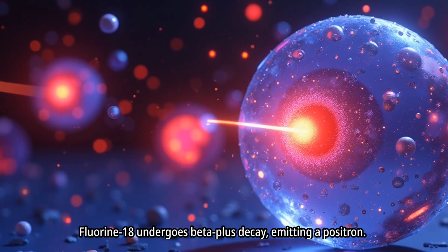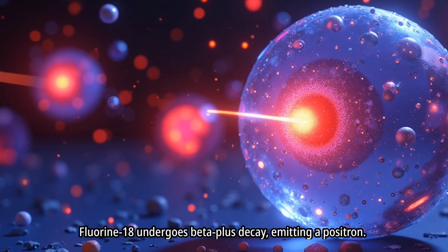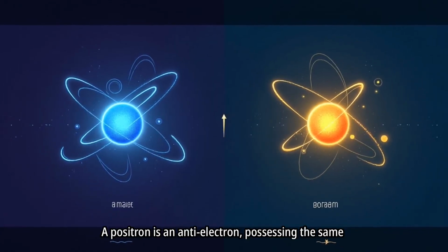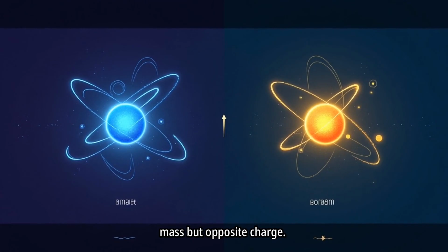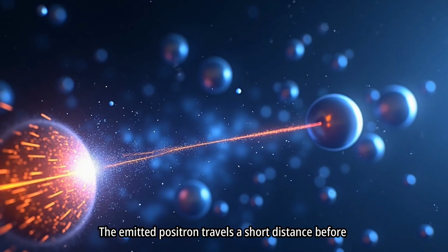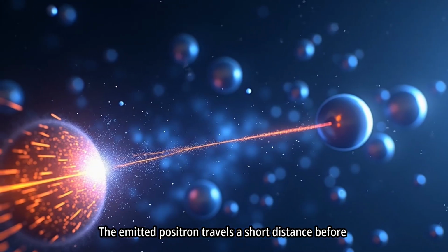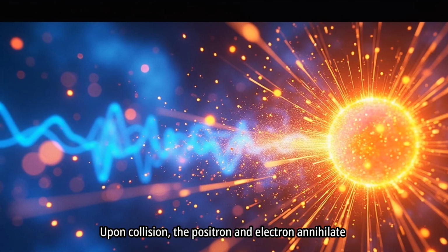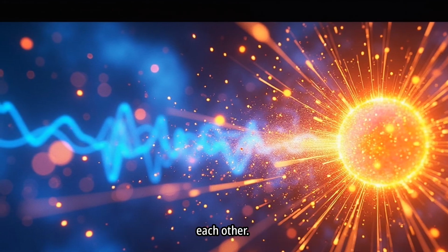Fluorine-18 undergoes beta plus decay, emitting a positron. A positron is an anti-electron, possessing the same mass but opposite charge. The emitted positron travels a short distance before colliding with a nearby electron. Upon collision, the positron and electron annihilate each other.